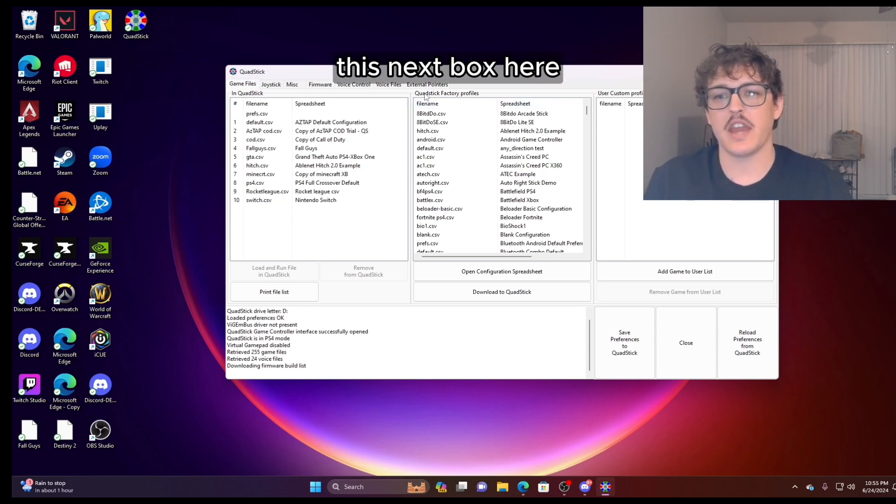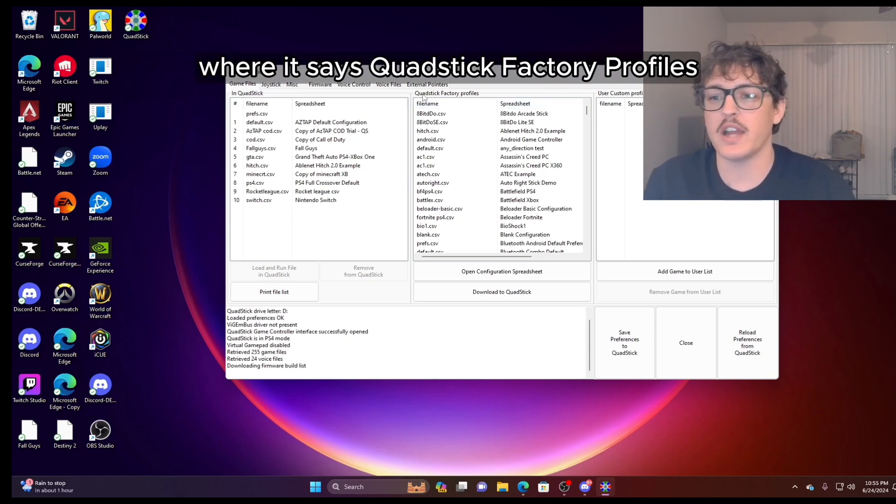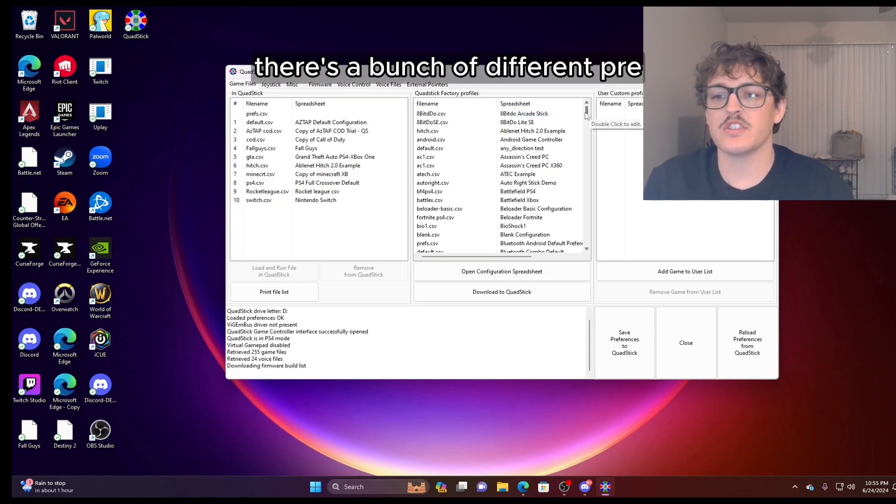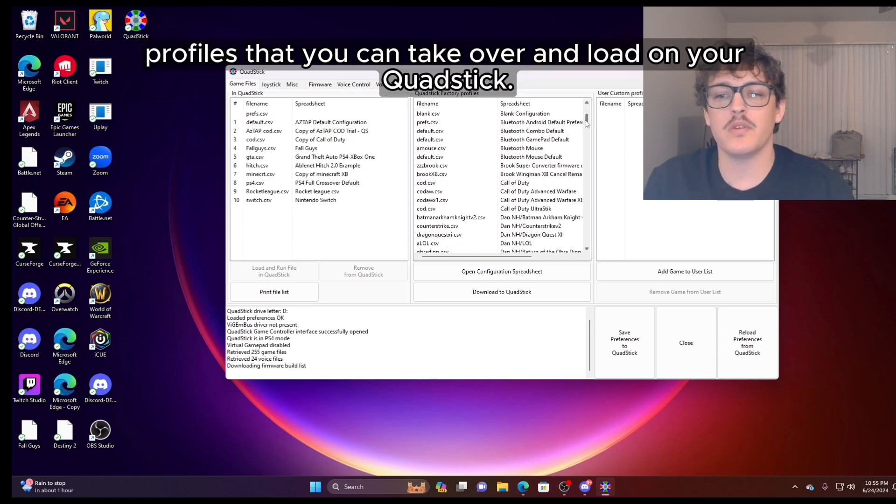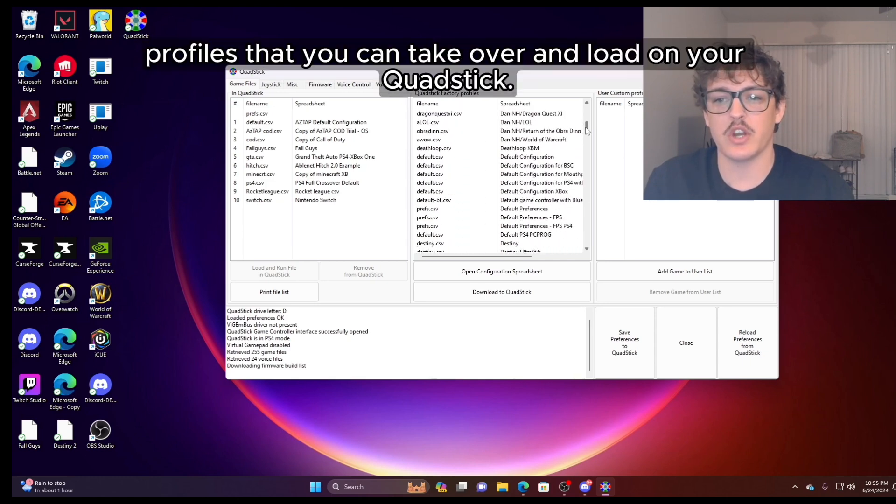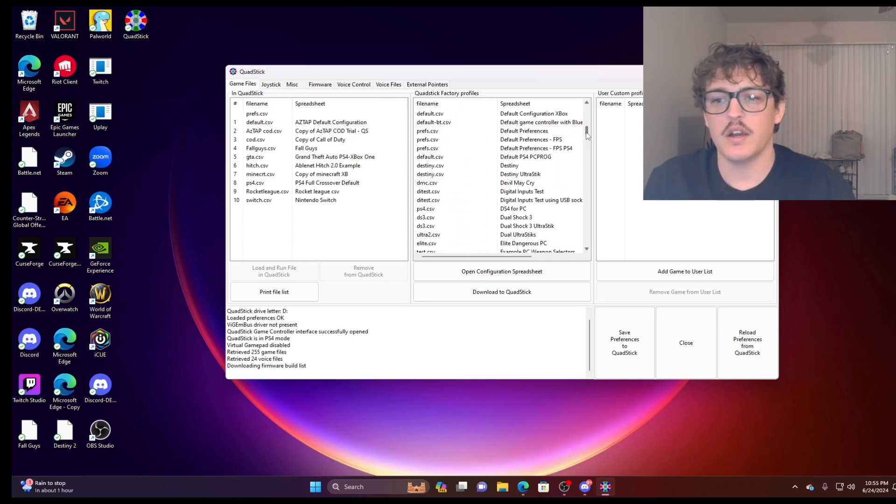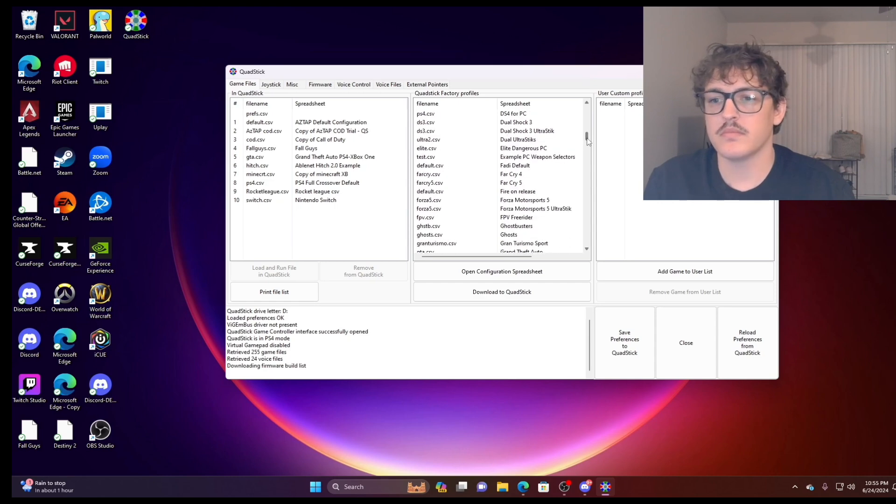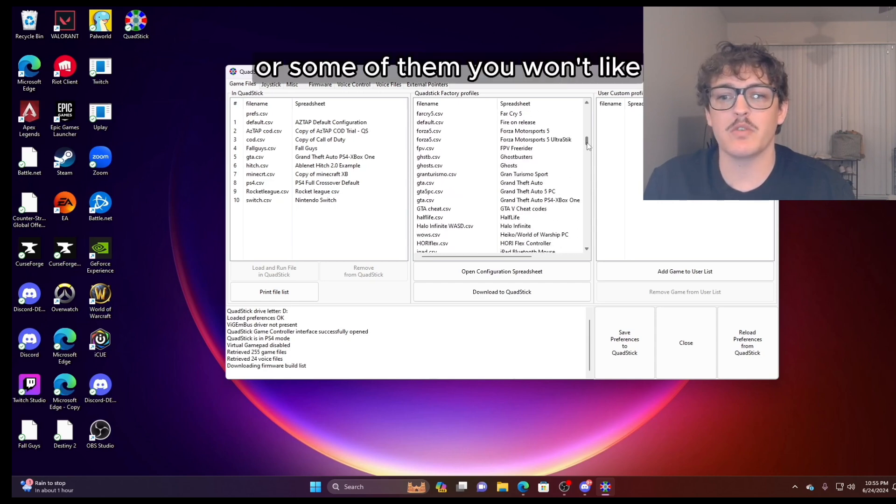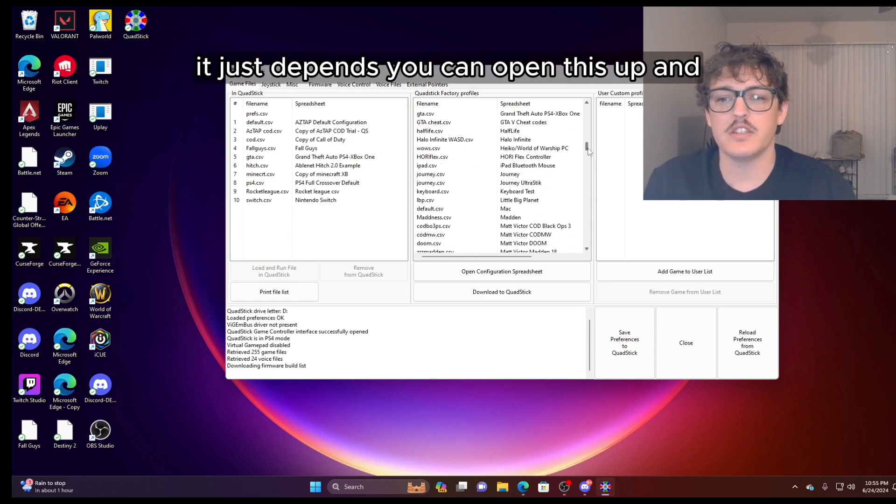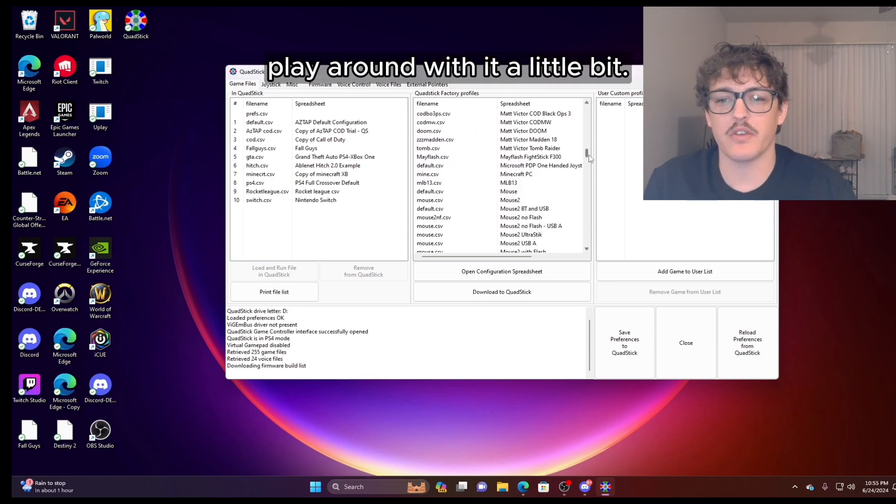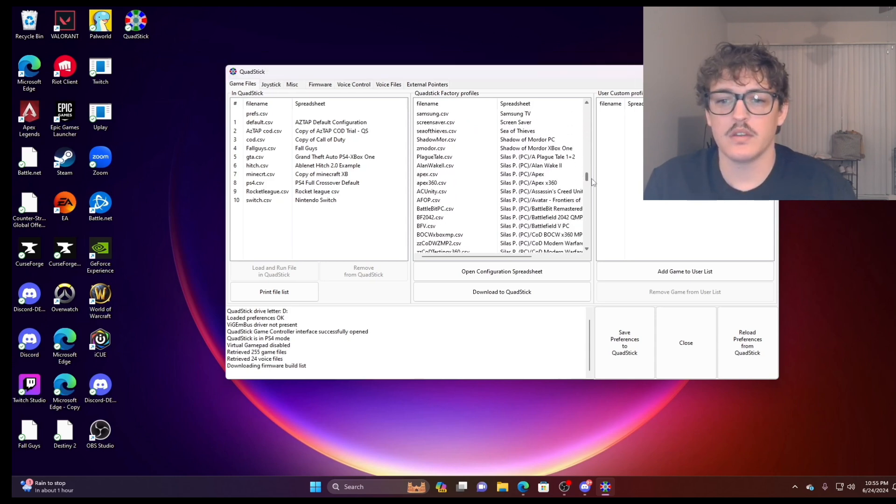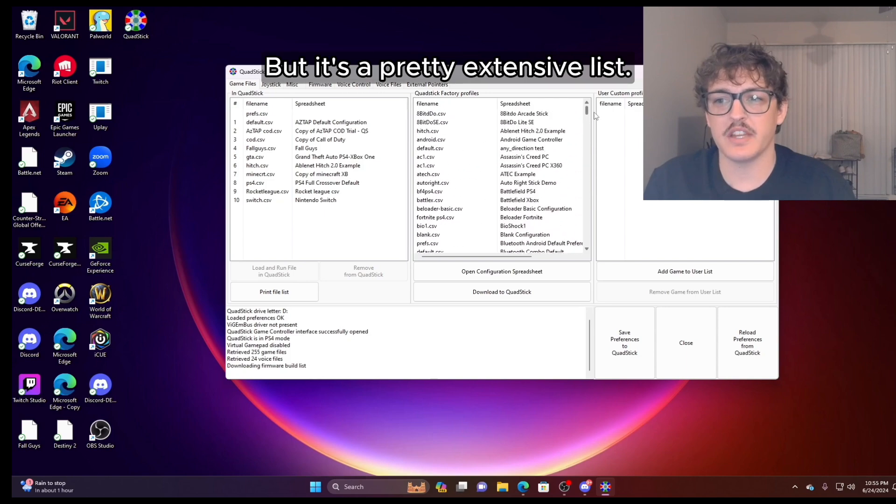In here, this next box here where it says QuadStick factory profiles, there's a bunch of different pre-loaded profiles that you can take over and load onto your QuadStick. And some of them you may like or some of them you won't like. It just depends. You can open this up and play around with it a little bit. But it's a pretty extensive list.